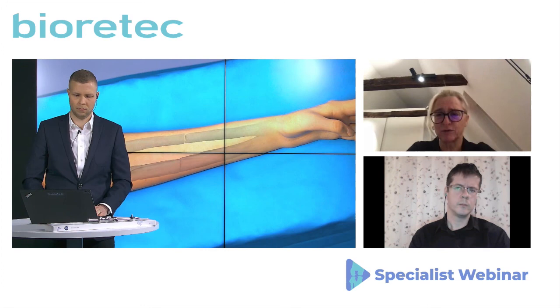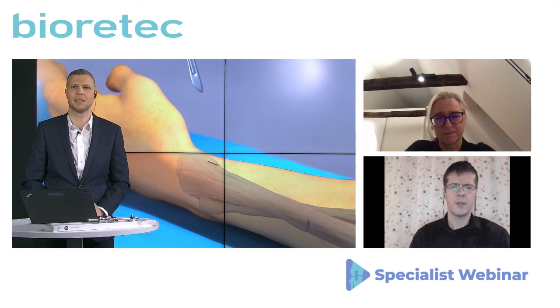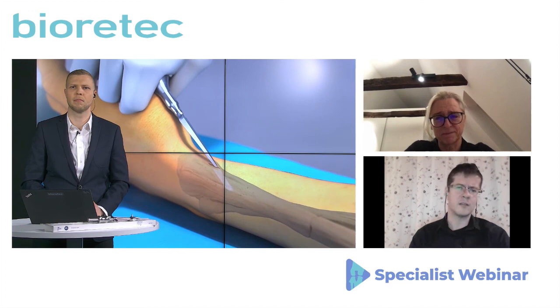But I know that it's done like this in some countries. I think there are more reasons to remove the nails, not just the immune system. I think most surgeons around the world remove the nails, not just because of the immune system, but because after a few years there will be such great osteointegration that it is almost impossible to remove the nails. And if there is any other problem, like a fracture near the nail, or some kind of pathology, it will be a very hard situation.